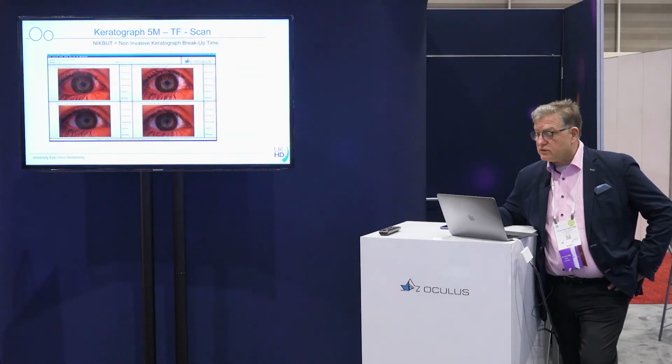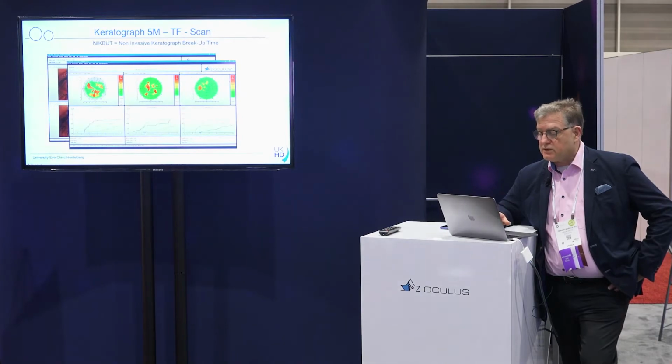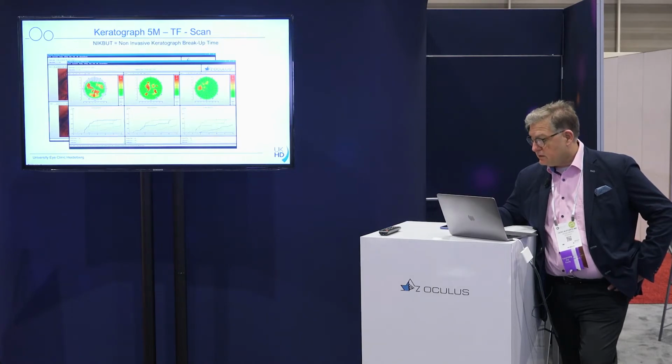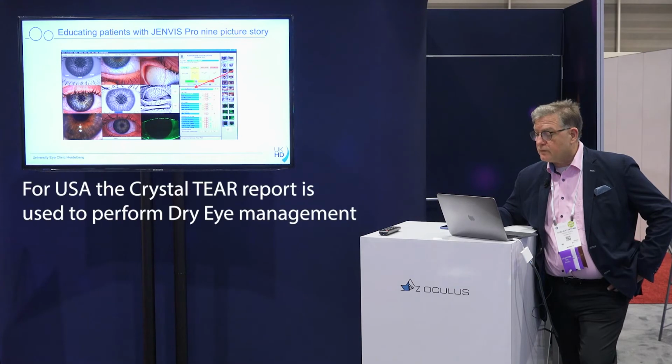The non-invasive keratograph breakup time gives you a very detailed image where the tear film is good or bad and where it starts breaking up. You can really quantify that almost, and you can also use that for follow-up studies very nicely. So it's a very, very interesting tool.